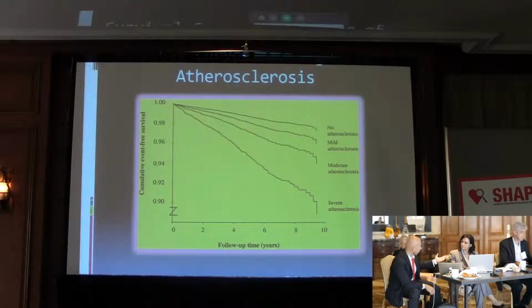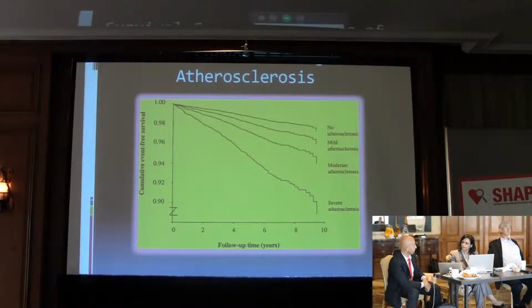I was thinking, you said carotid is the later stage? Correct. So aorta is predominantly the first, and then iliac and femoral and so on. If you are able to do a protocol like what Henrik is going to show, the HRP and PACES, where you do it in 20 minutes, you scan four beds, 2 femorals and 2 carotid, you're saying you will have a greater chance of collecting pretty much everybody, even those who have zero coronary calcium. Correct.